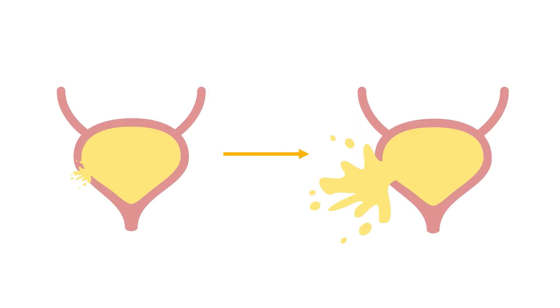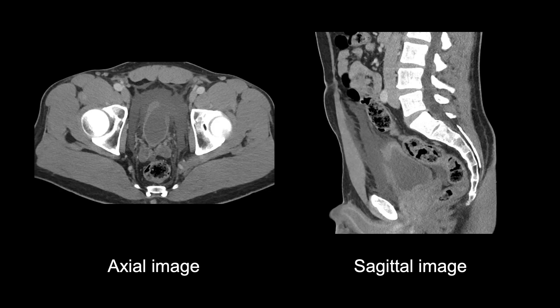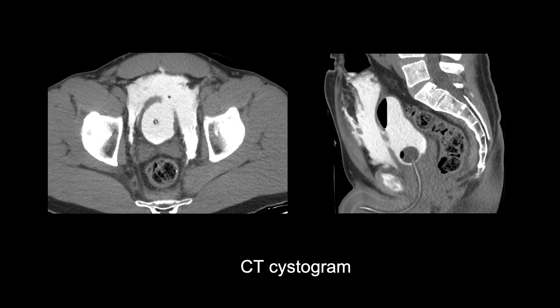Extraperitoneal bladder rupture can range from a very subtle to a large defect. This patient's trauma scan has quite a lot of fluid accumulating outside the front of the bladder in the pre-vesicle space or space of Retzius. This fluid has a simple fluid density of 15 Hounsfield units. There is a visible defect in the anterior bladder wall indicating injury. A follow-up cystogram was performed which showed a gaping hole in the bladder confirming injury. When contrast was inserted into the bladder, it leaked into the pre-vesicle space but not into the peritoneal cavity or surrounding the bowel loops.